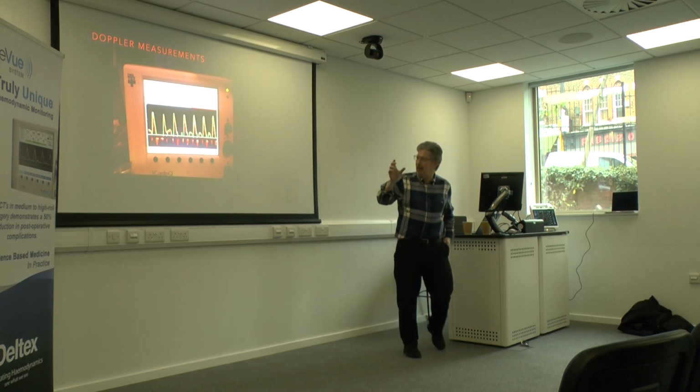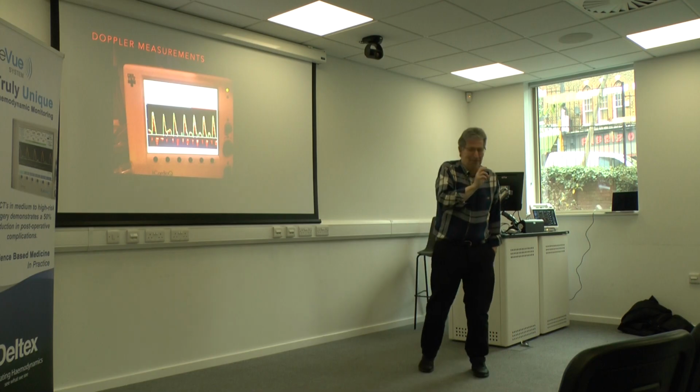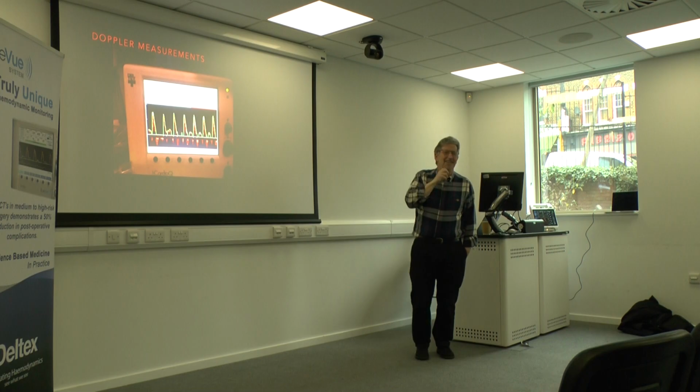And this is years ago, and this was actually with the nurses. I didn't have a camera on my mobile phone at the time. The nurse very kindly took some photos and a little video for me. Okay, that was the Doppler. I'll show you the other numbers in a second.